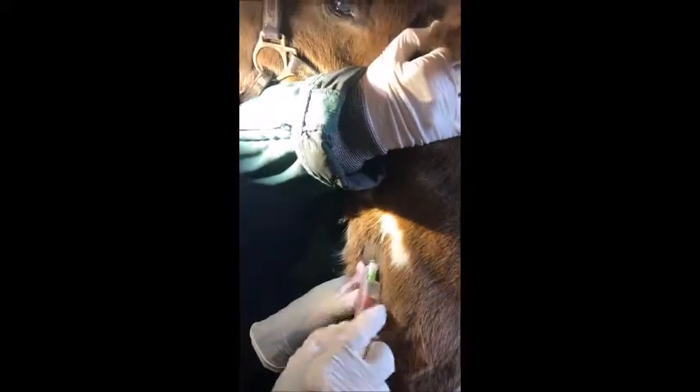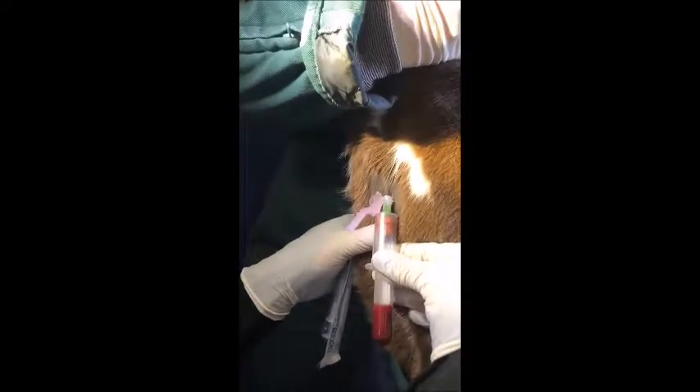Disinfect a little bit with some alcohol, occlude your vein, insert your needle parallel, attach the accutainer, and blood will fill.